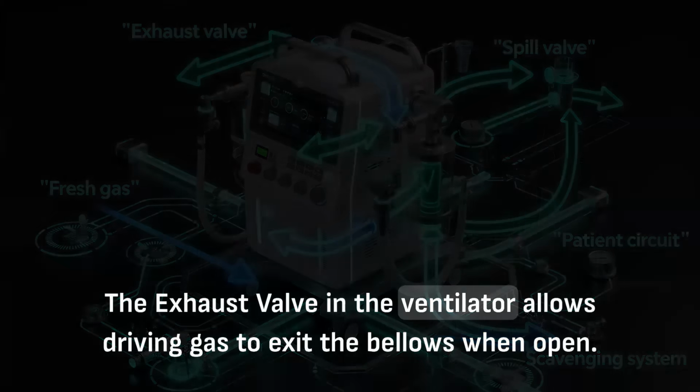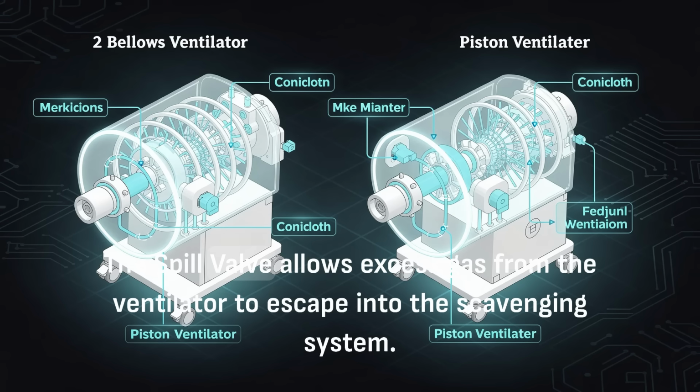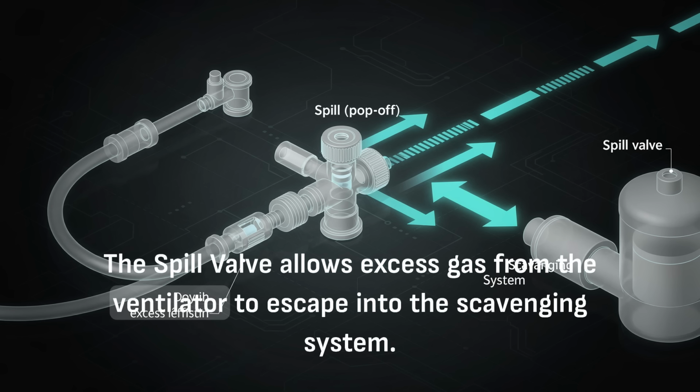The exhaust valve in the ventilator allows driving gas to exit the bellows when open. The spill valve allows excess gas from the ventilator to escape into the scavenging system.